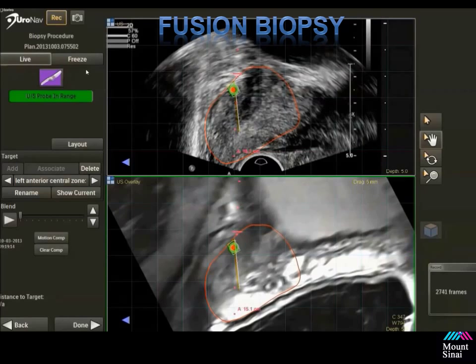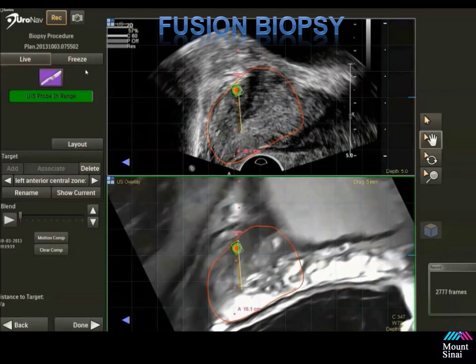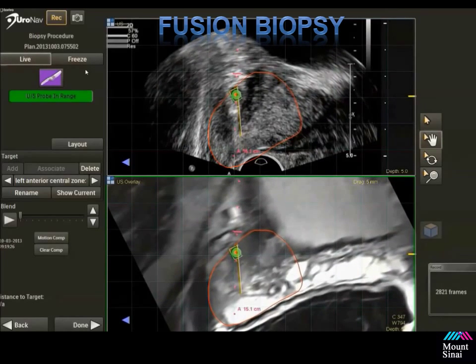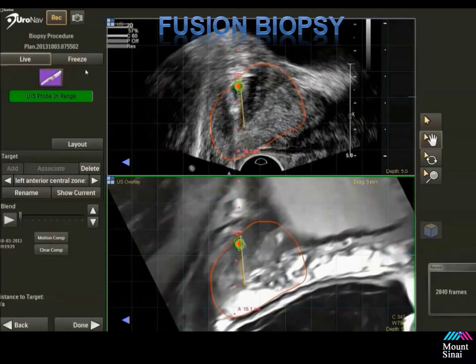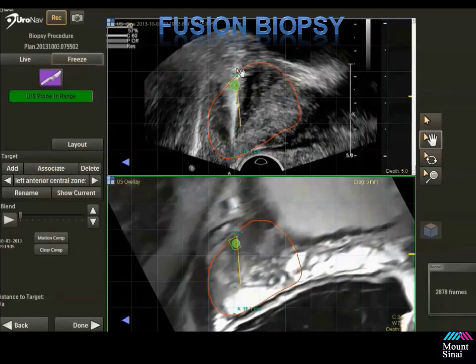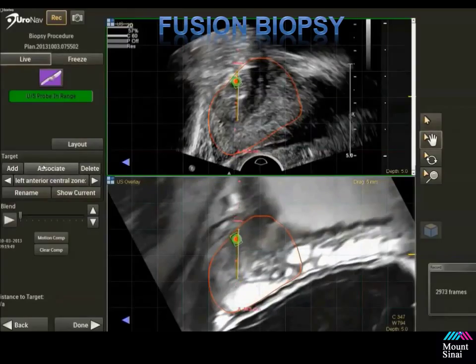It's very important to understand that this is a live case you're able to look at dynamically. You can see how movable the prostate is, so it's difficult if you were just using cognitive means to locate this anterior lesion. Notice how the needle is placed right in front of the lesion, placed into the prostate, and then sampled. The needle is then removed, and we mark the region to record where we sampled. The record button should be on so you can track your progress and review the information with a radiologist. It's important to have pathology correlation when performing this to improve your technique and your radiologist's technique as well.